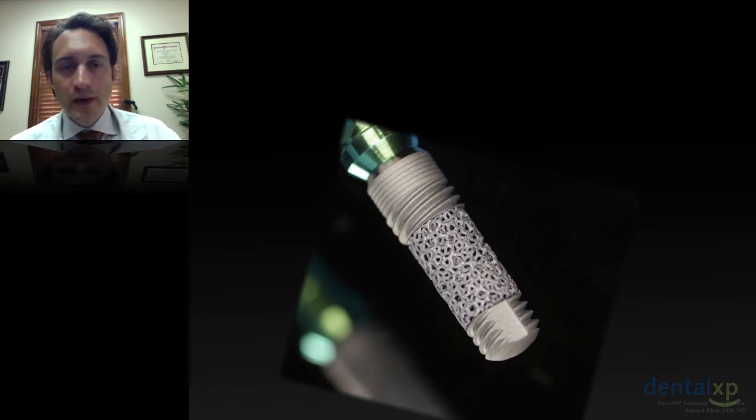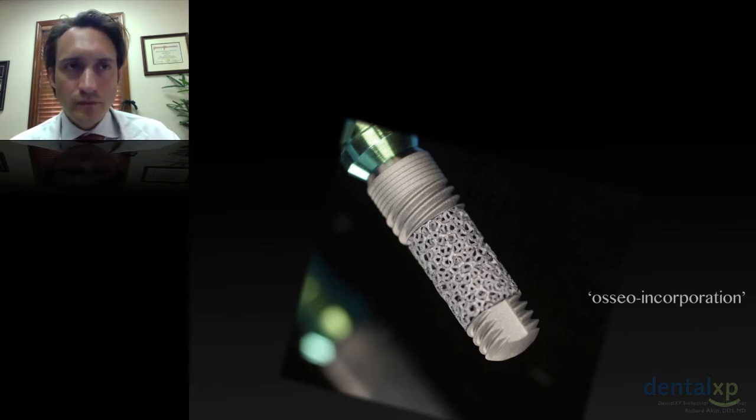When we talk about new implant surfaces and new implant designs, there are new words that we can use when applied to these new technologies. One is osseoincorporation. You can think about bone, as opposed to, excuse me, bone on-growth, we're talking about bone ingrowth. And this trabeculation that you see in the implant here is where we get bone incorporation and bone ingrowth.